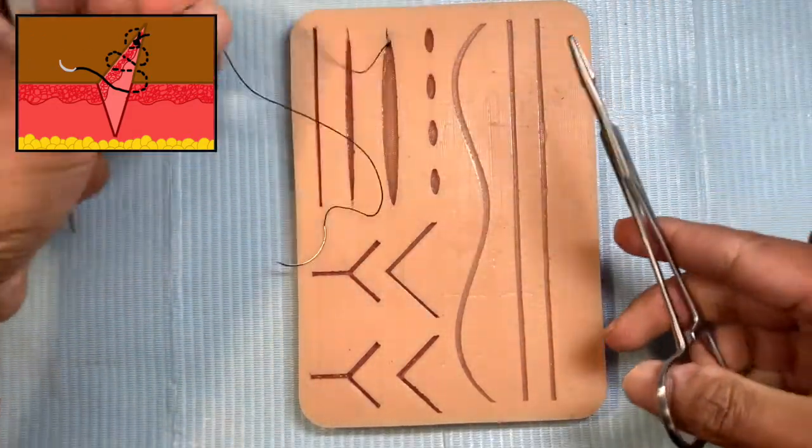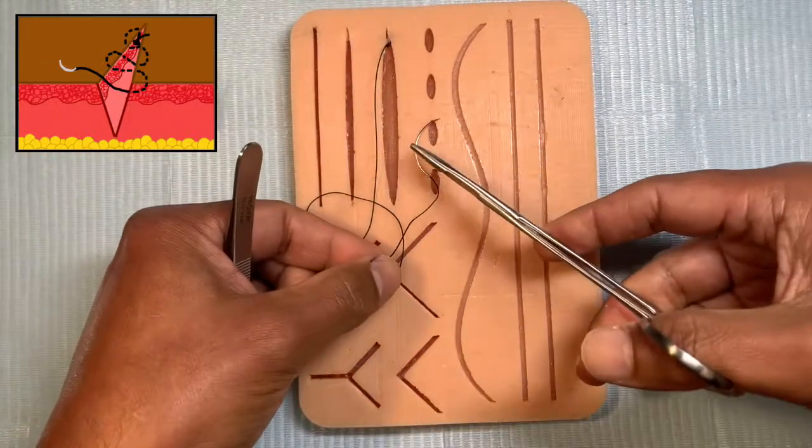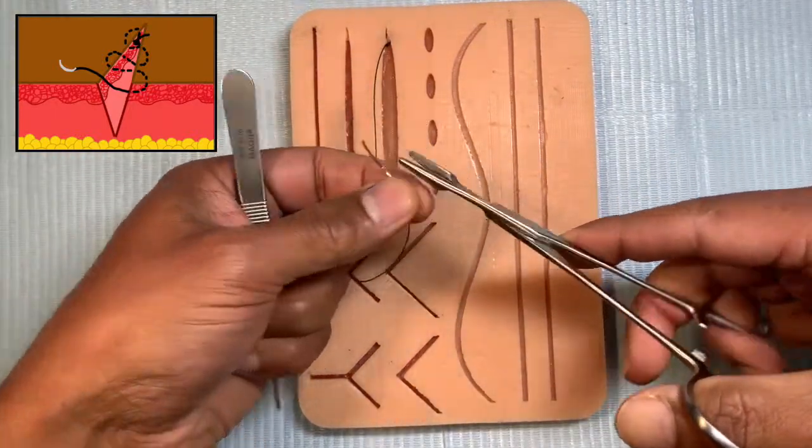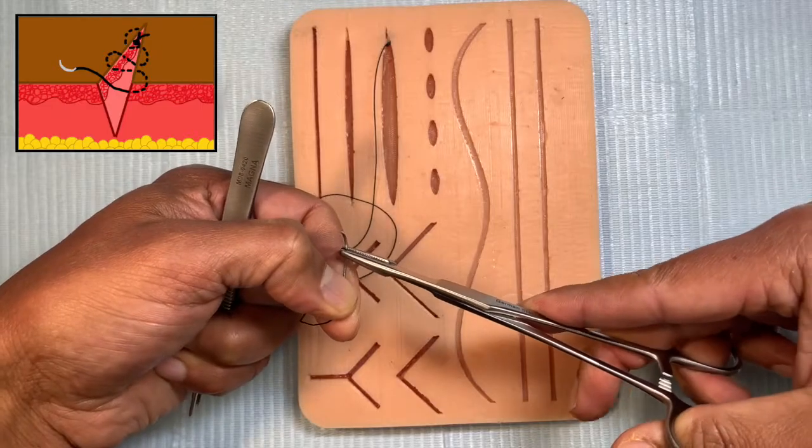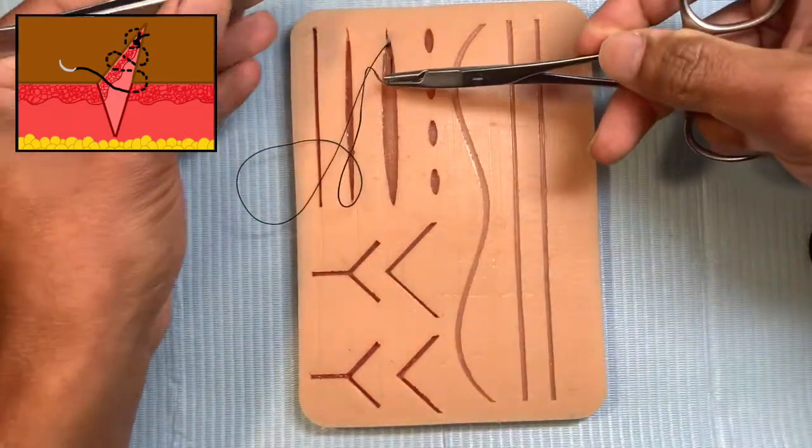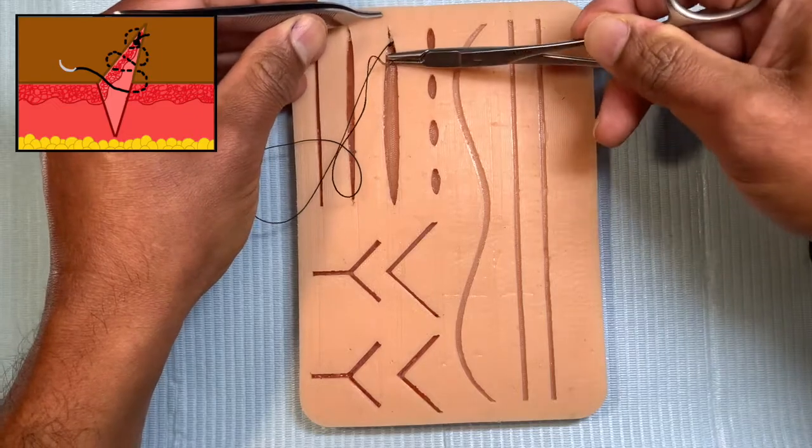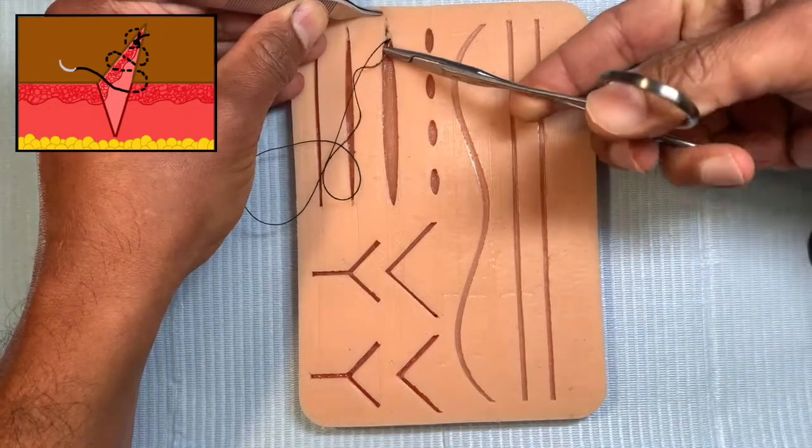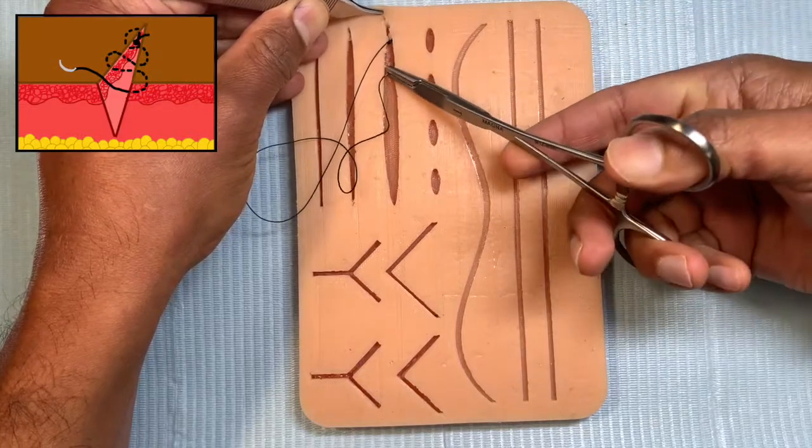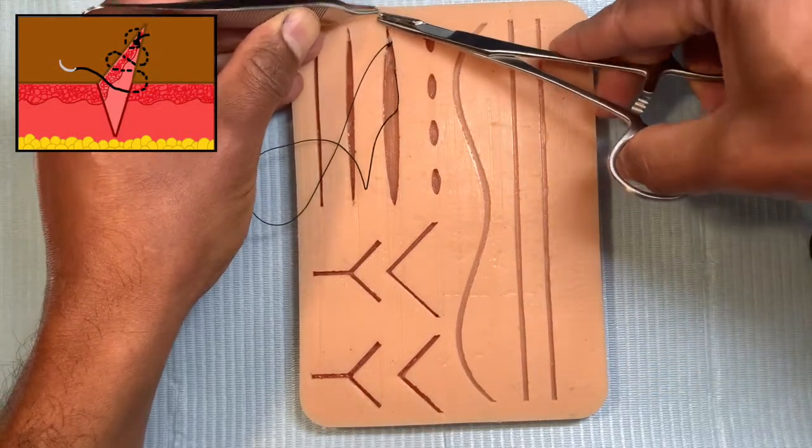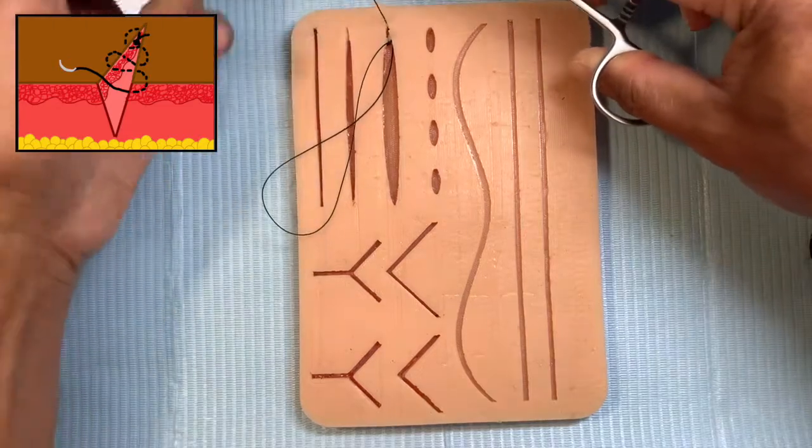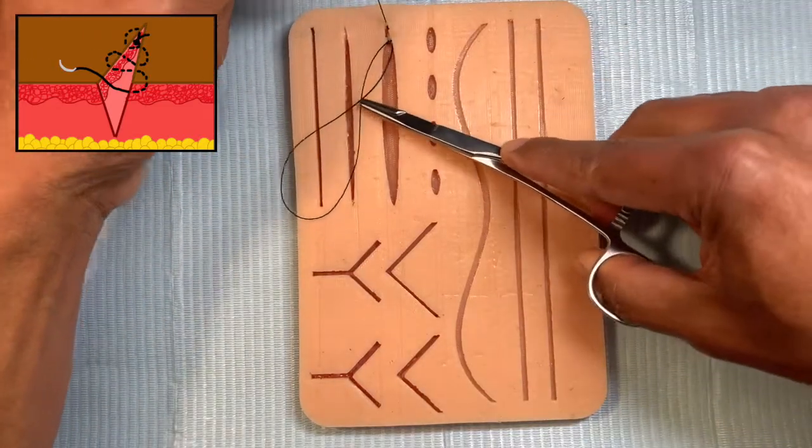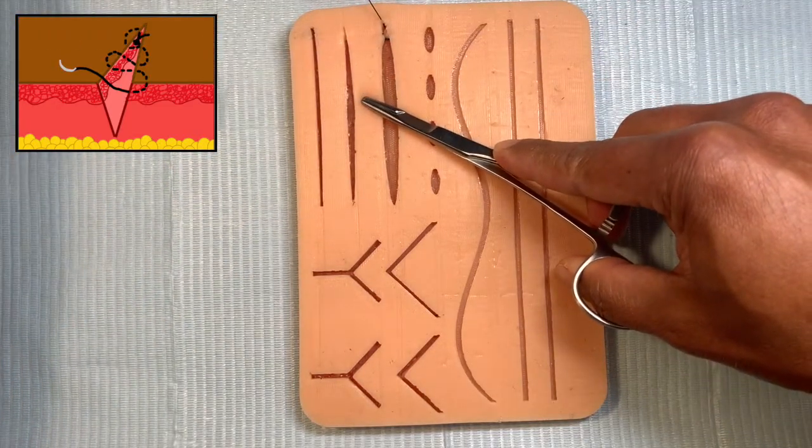Now you've got good anchorage, but you want to start right from the edge of the wound. Pass this needle all the way to the edge of the wound. Don't come out through the skin itself, but pass it through the papillary dermis, which is the layer just below the epidermis.